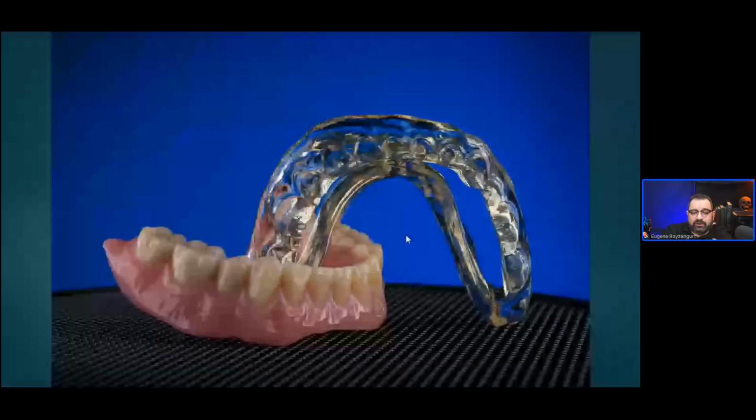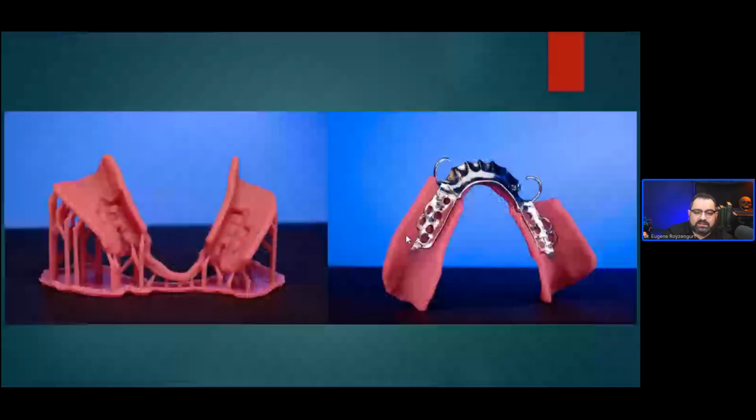Surgical guides. If you're doing a duplicate denture, surgical guides like I do often nowadays, if you did those by hand before, you used to be covered in acrylic head to toe. Nowadays, it's a lot easier. I just do this in Meshmixer and then get them printed and get them out the door. So these are most of the things that I do.